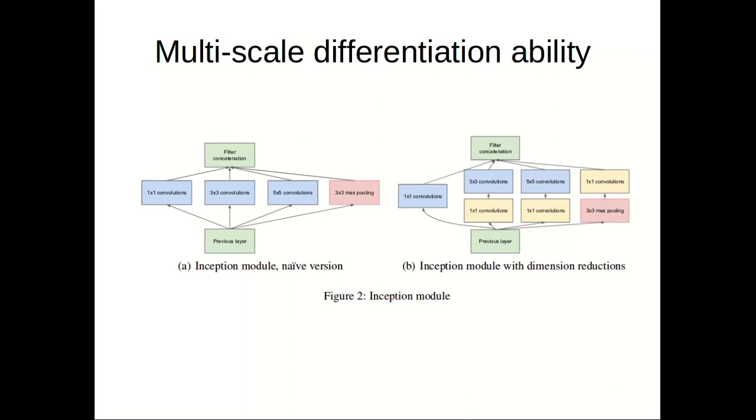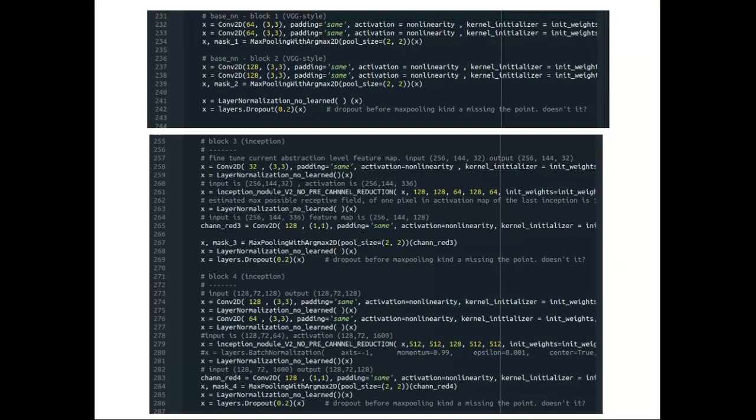There are several ways to do that, and one of them is using an inception module. By putting several filter sizes together in the same convolutional layer, this results in a feature map that contains different receptive field channels. It also lets the model decide by itself the appropriate combination of receptive fields that is most fit for the task, as the parameters that weight the inception module feature map channels are incorporated into the loss manifold axes. Inception modules do have some drawbacks. Their reversibility is not so great, meaning that they tend to lose information. So we want to use them with some caution and only when necessary.